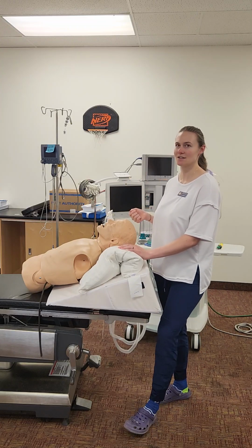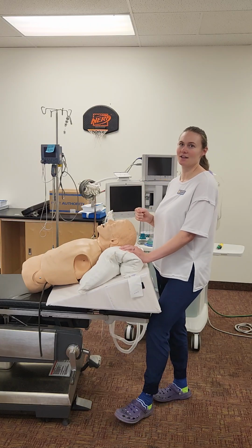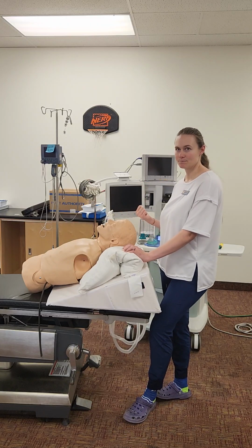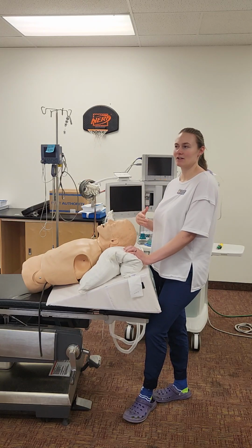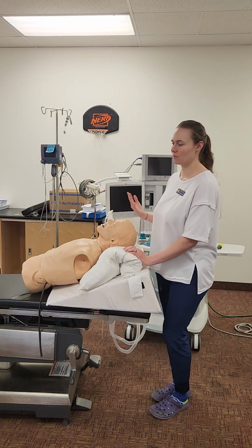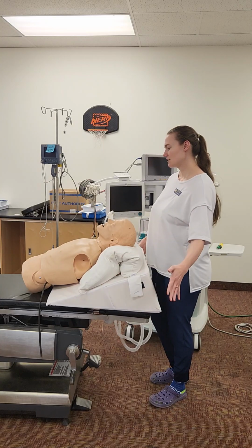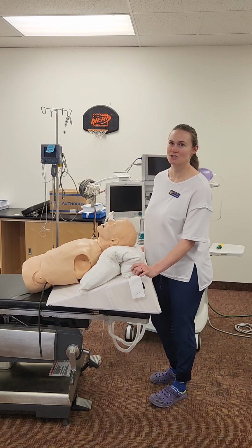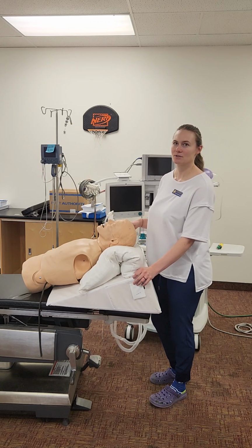And now for the end of the case, they're wrapping up, so I can use my sugammadex, because he still has, not all 4 twitches are back, so I'll use my sugammadex, and then we're going to do an awake extubation, because we don't want his airway obstructed, or him to be hypoventilating, or us to just have issues with him waking up and going into further emergency issues. So the surgeon said that these were okay, so he's waking up in the same exact position, and I'm just going to wait till he kind of progresses up to awake.